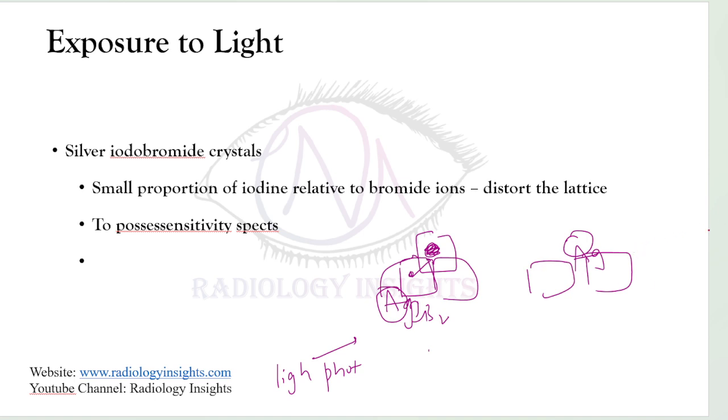This distribution of specks of silver within the emulsion forms a latent image, which is waiting for development.